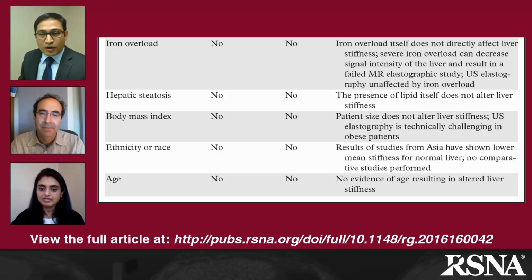And so far in all the publications which we have seen over the last 10 years, age and sex do not affect liver stiffness. Although someone might wonder whether men may have more liver stiffness compared to women, and maybe it is related to alcohol intake, but we don't know. We cannot say anything about that.